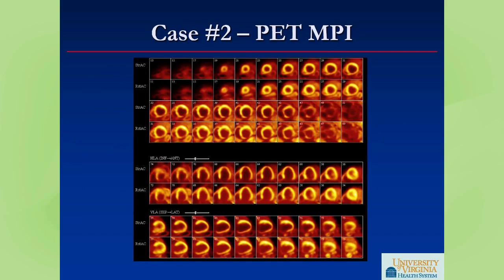So he undergoes cardiac PET CT, and you can see here that the perfusion is abnormal. There is what looks to be an apical, but especially mid to basal inferior and infralateral perfusion defect that appears to be predominantly fixed if you look at the images more basilar. But as we come more mid, we can see that there starts to be more reversibility. And so this defect was thought to have at least partial reversibility and therefore be consistent with ischemia and infarction.